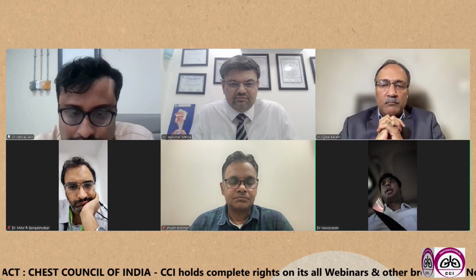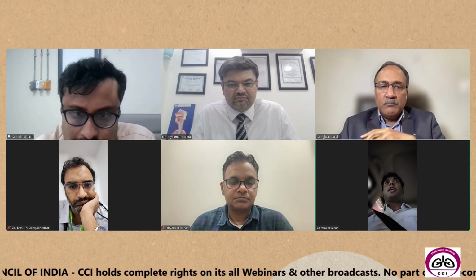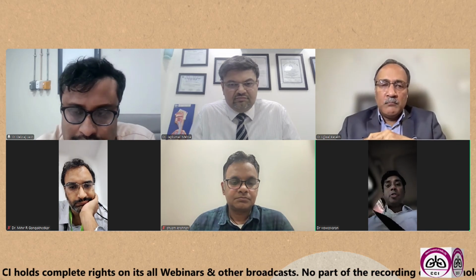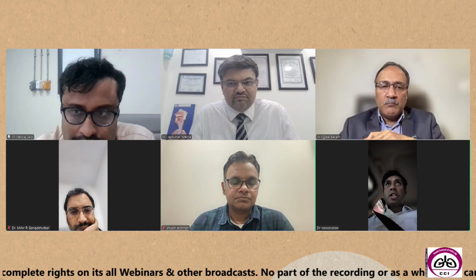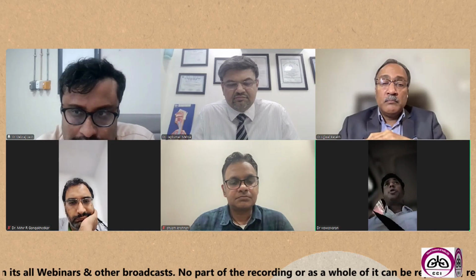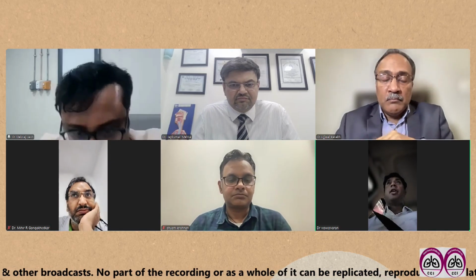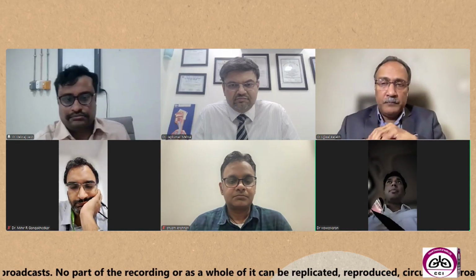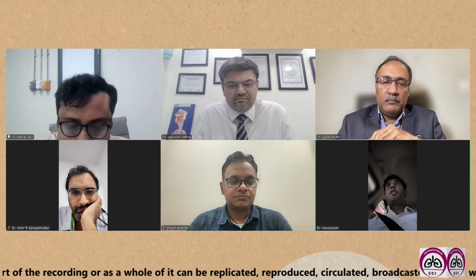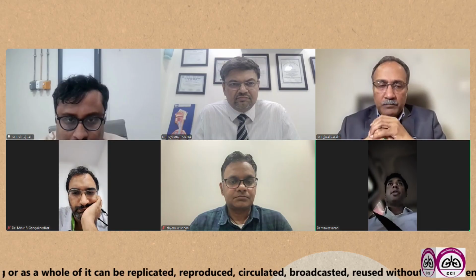So sitting with the company, whichever scope you are using, and understanding from the technician about all the details pertaining to gain, what is meant by gain, what is zoom, what is depth, and how to measure the lymph node, and how to individually handle the scope, wash the scope, and handle the needle. All these things are very, very important. Even though it looks small, these are the things where you need to give a lot of importance before you actually start procuring and start doing your EBUS by yourself.